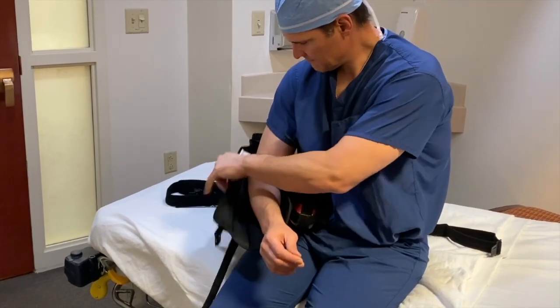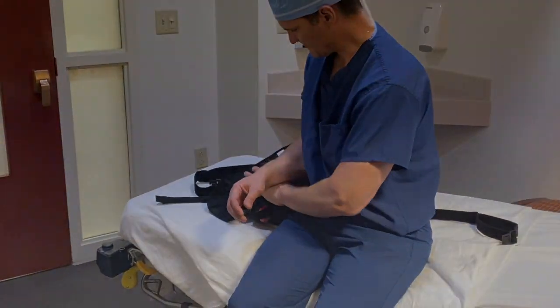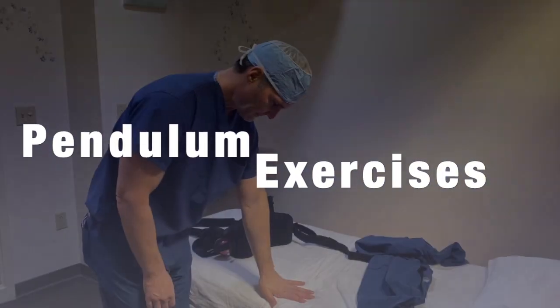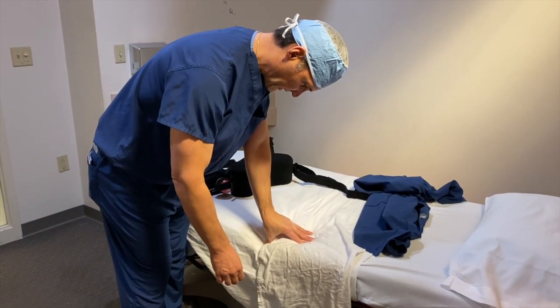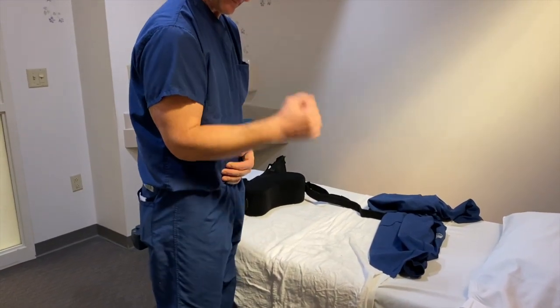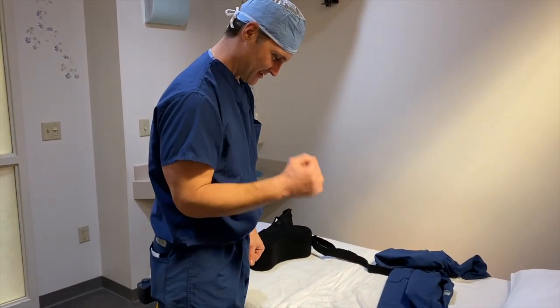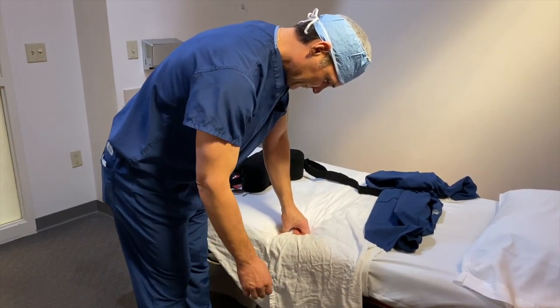Once you take the one by your waist off, you can then remove the strap that's across the top of your forearm and by your thumb, and then just slide the sling out from underneath your arm — and you can see in this video I'm not moving my arm very much. To get the shoulder moving without hurting anything, especially if you've had a rotator cuff repair, just let your arm hang and maybe move it five or six inches in each direction. You are allowed to bend your elbow or even raise your shoulders, but don't raise your arm away from your body — that way it'll protect whatever has been repaired in your shoulder.